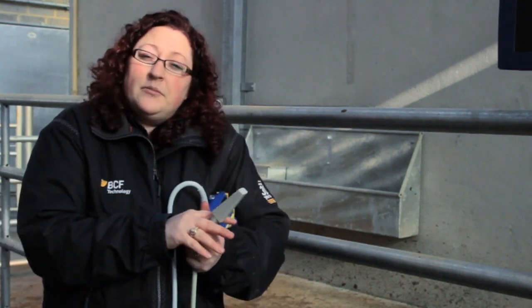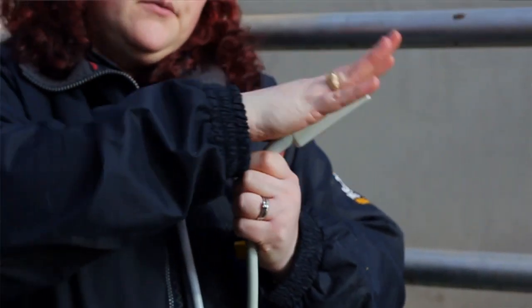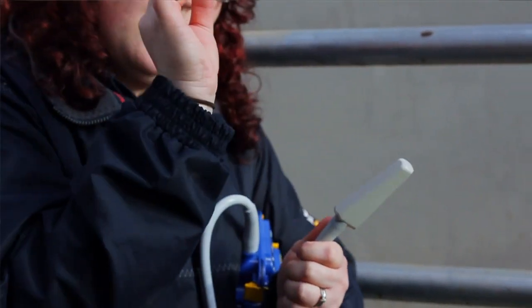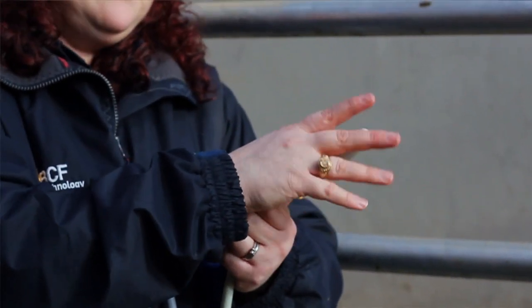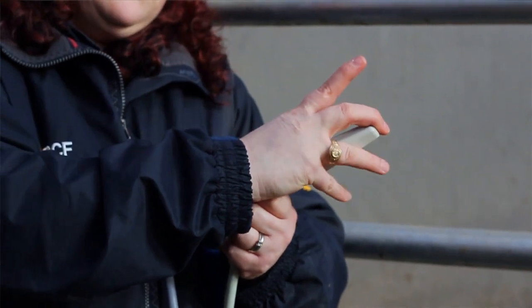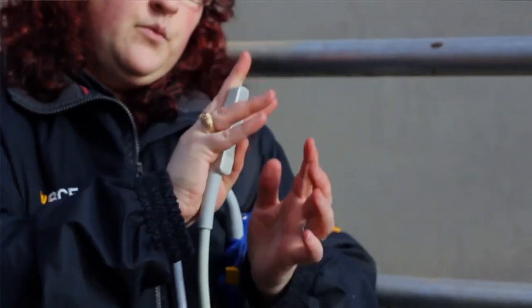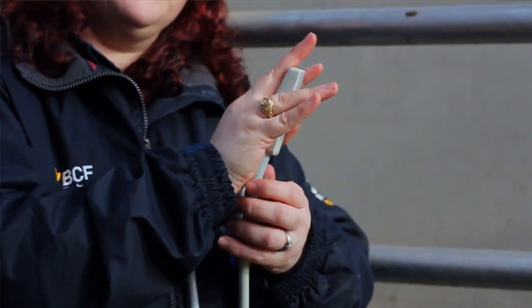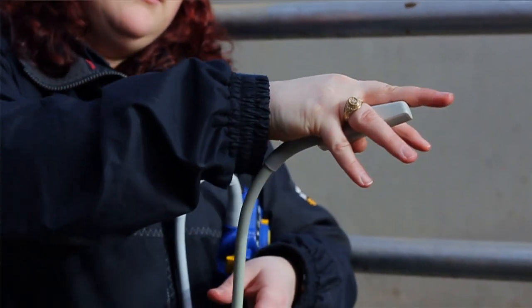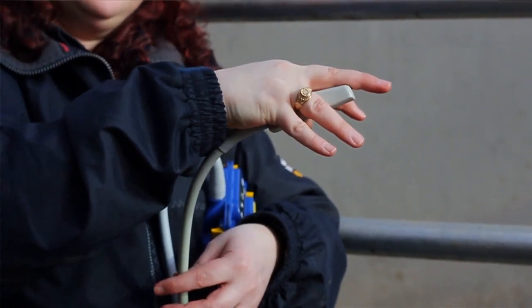So a couple of tips to remember. If you hold the probe cupped within the palm of your hand and keep one finger near to the very tip, so the very end of the probe, which will correlate to the left-hand side of the screen, you can then grasp the remainder of the probe in your hand, and with your 2 fingers that are free on either side, and potentially your pinky as well, you can then feel the structures that are around the probe, such as the uterus.